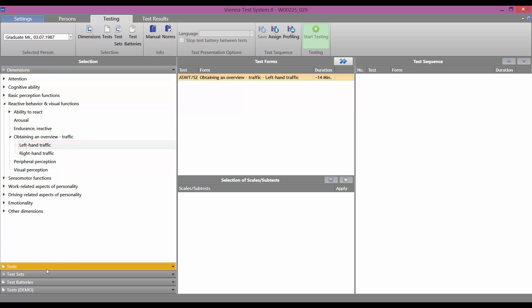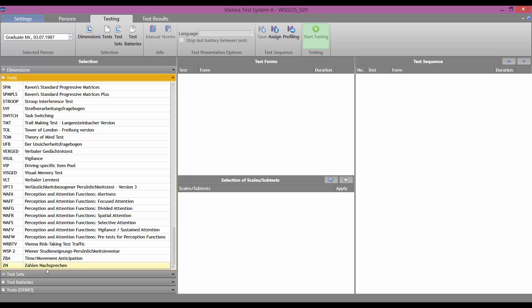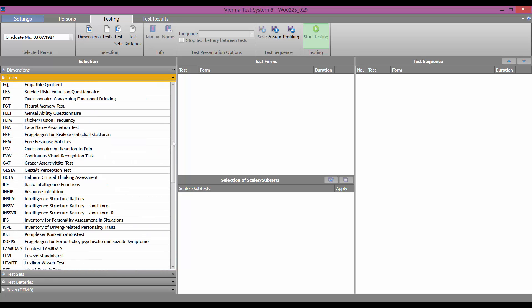Secondly, by tests. All the tests for which you have a license are listed here.